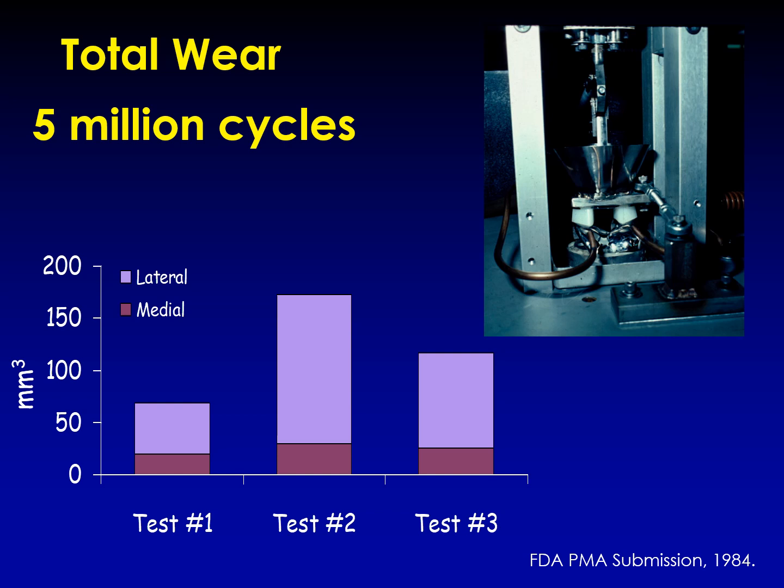In this regard, multi-station servohydraulic and electromechanical implant simulators are employed. As has been indicated, their use requires long-term in vitro evaluation, is costly, and unfortunately does not always align with retrieval patterns. I am sharing with you my early experience in evaluating the meniscal bearing wear volumes required by FDA to establish safety and performance for the first device of this type.